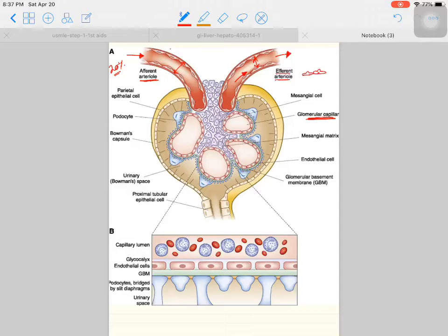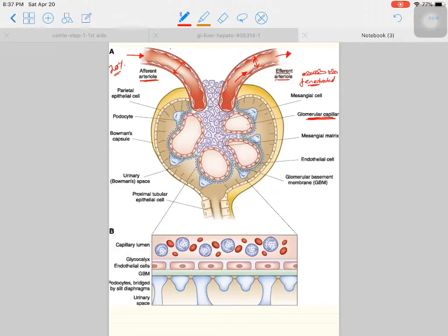The glomerular cells have fenestrations and gaps between them. These fenestrations help in filtration, so they are called fenestrated capillaries. These fenestrated capillaries have fenestrations that play a key role in the filtration process.